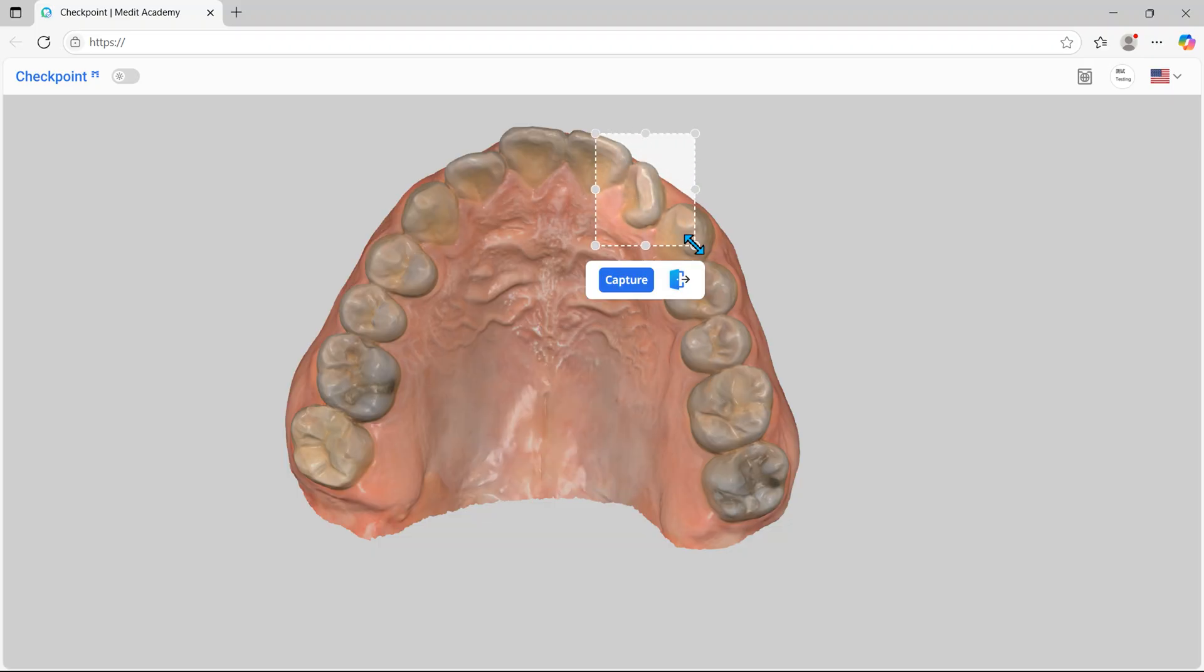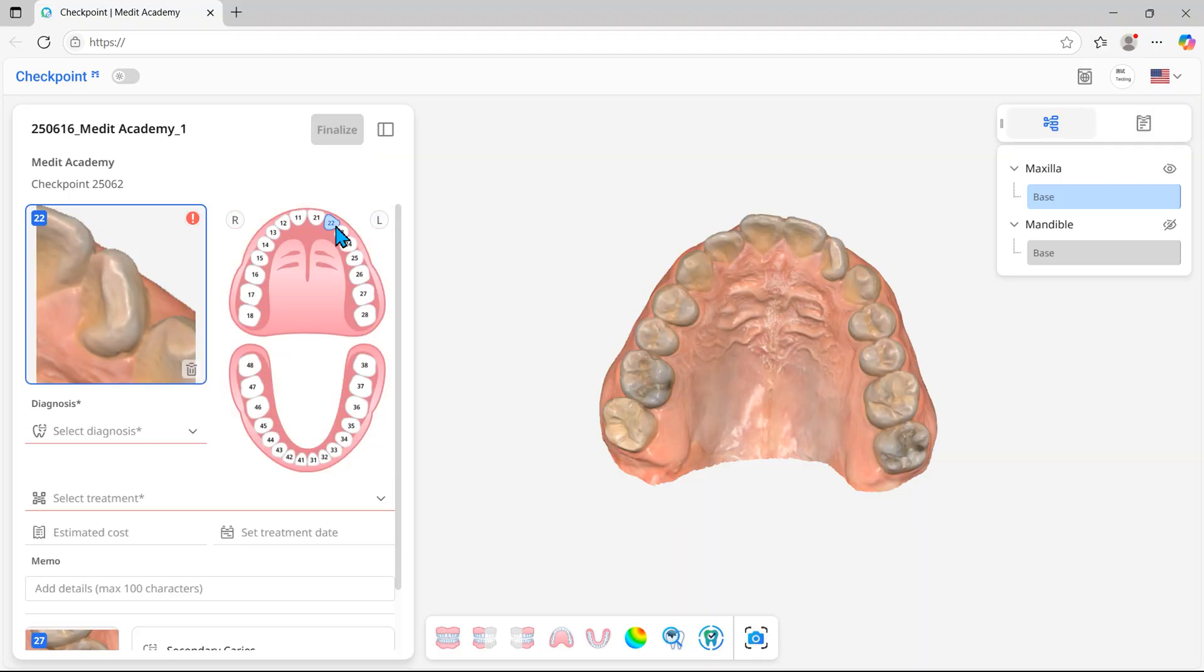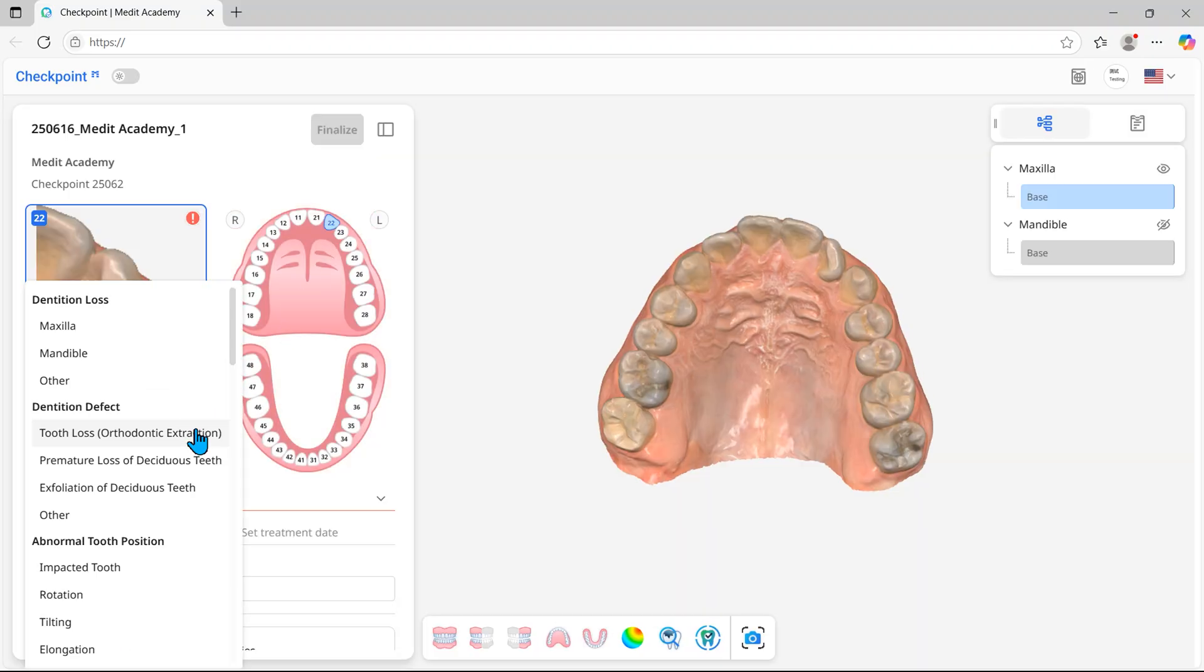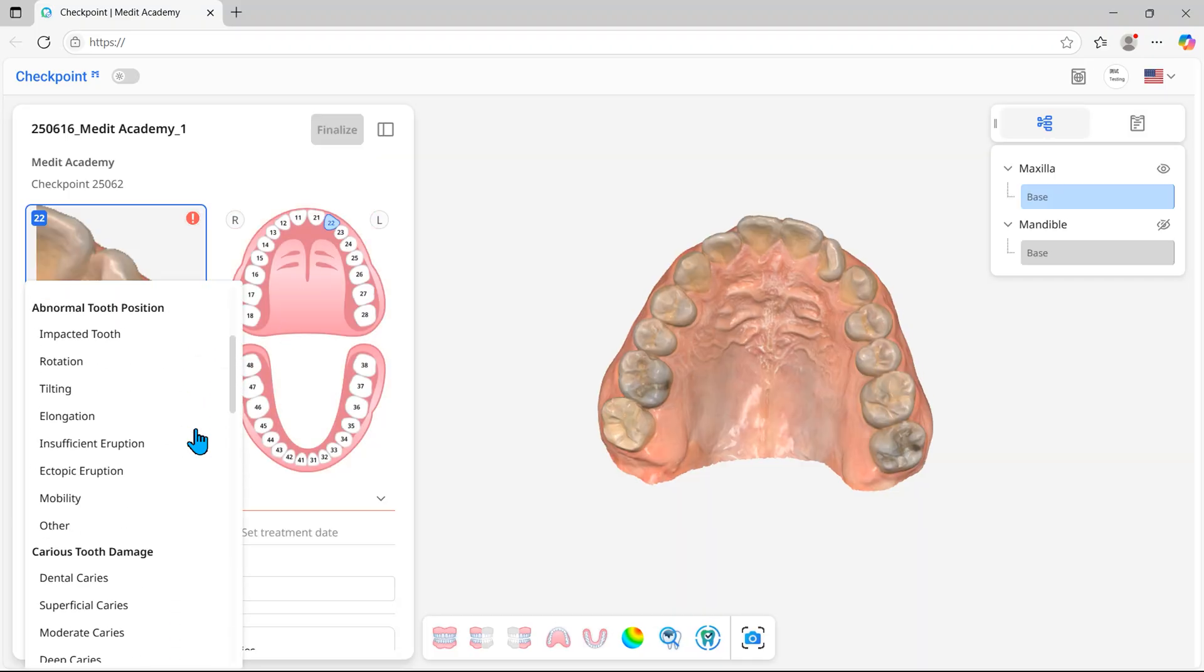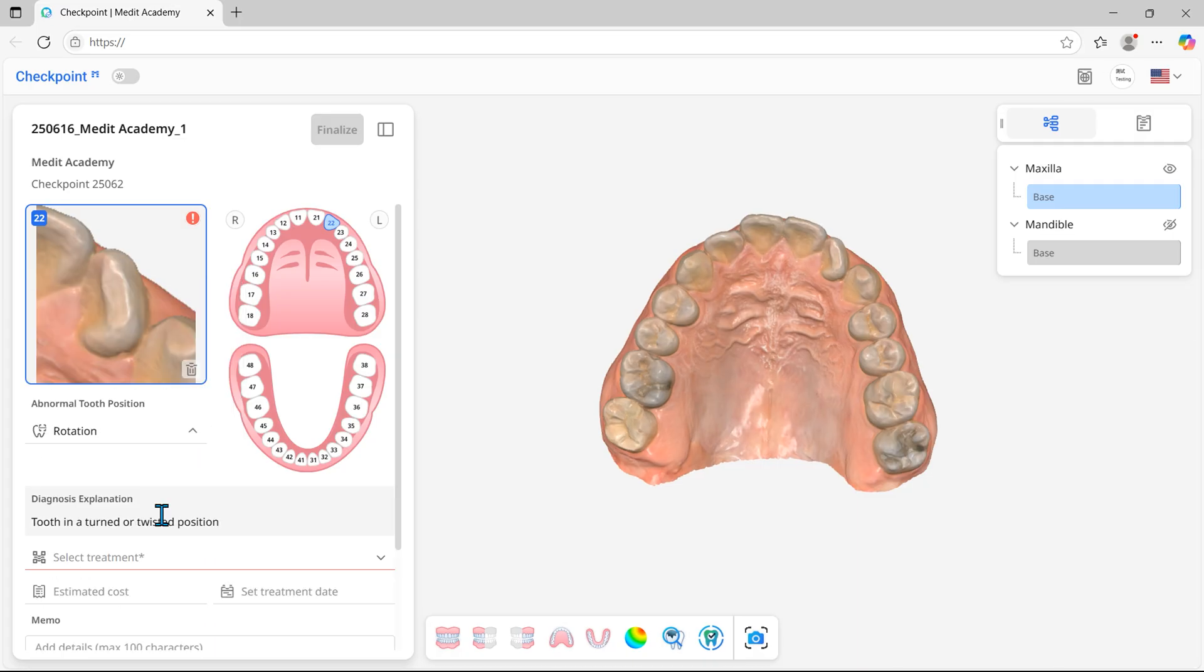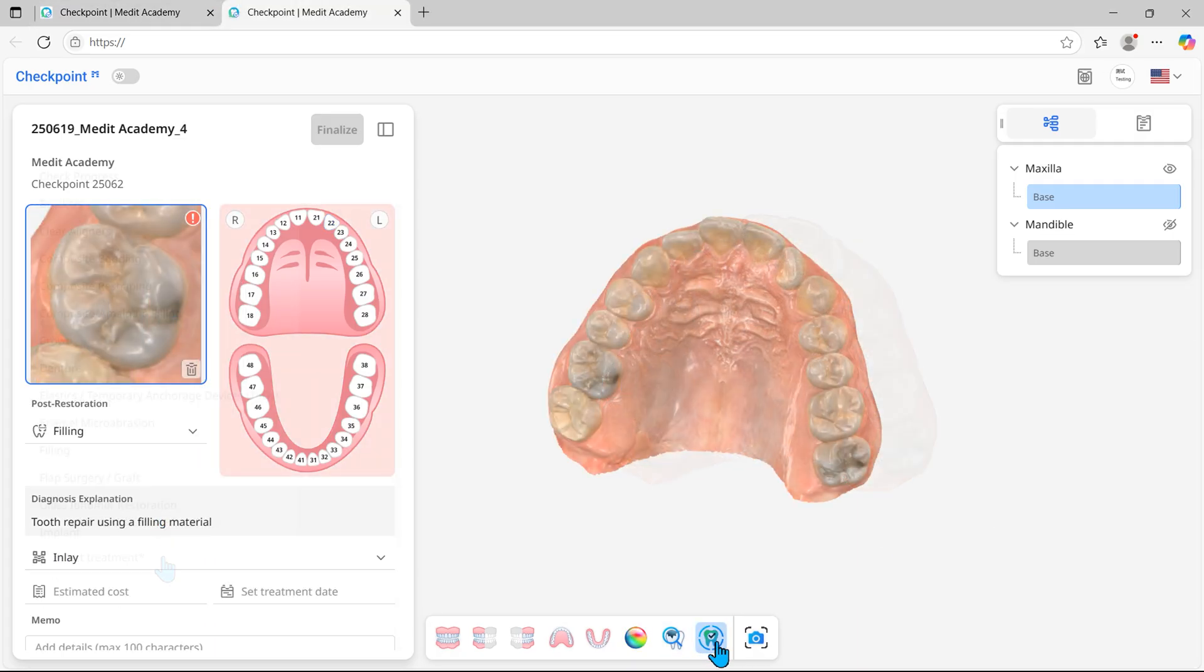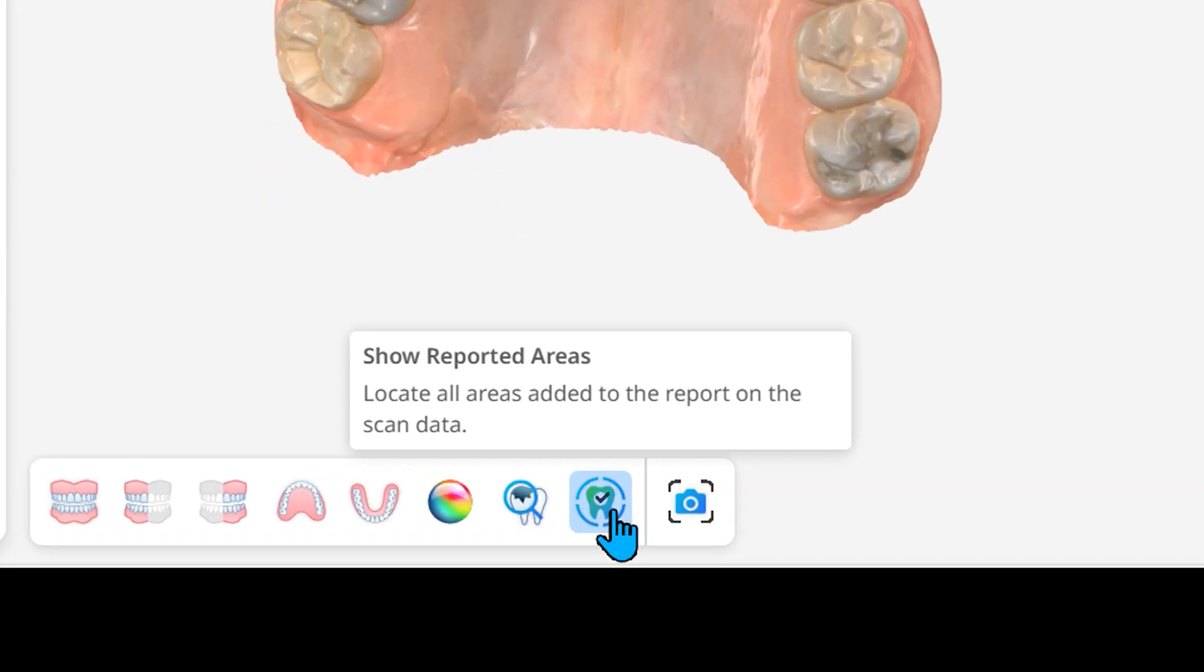Similarly, create diagnostic reports for all areas of concern on the patient. Click Show Reported Areas to view all captured areas at once.